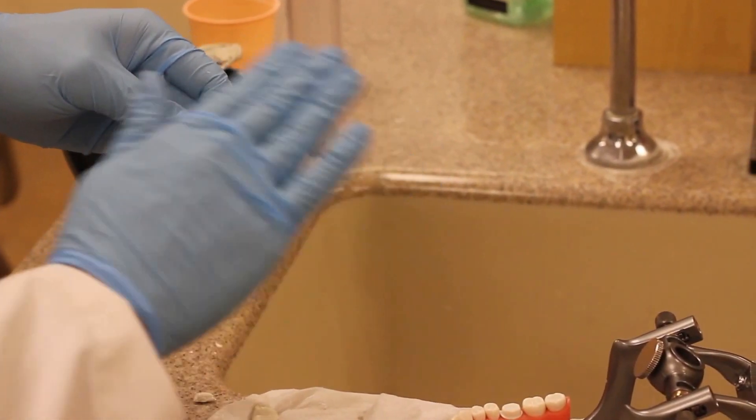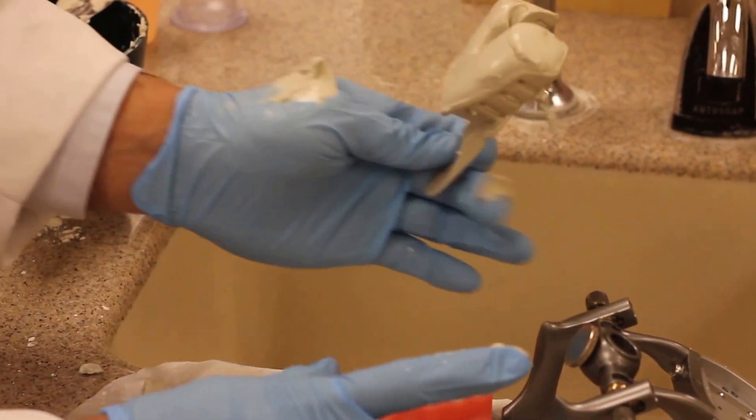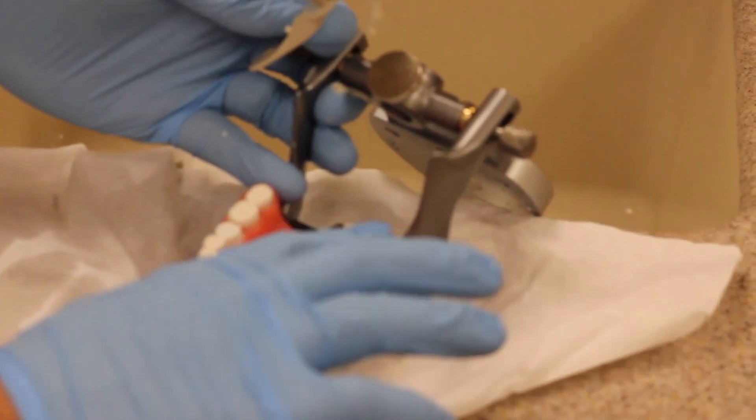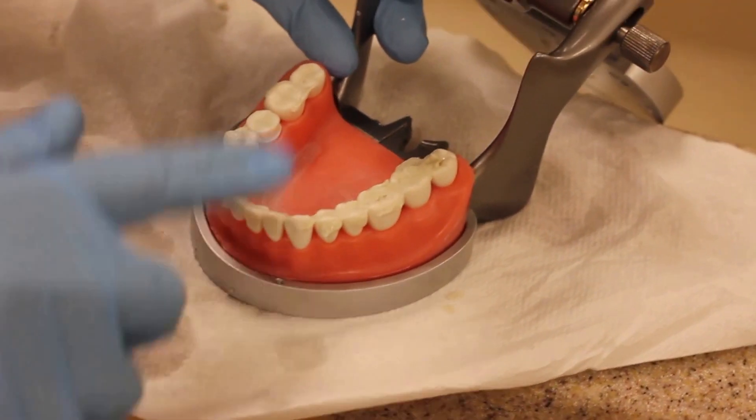Get rid of some of the excess again. I'll tend to smooth things out. Sometimes you'll have some extras. And again I really want to make sure the alginate is on the occluding surfaces.